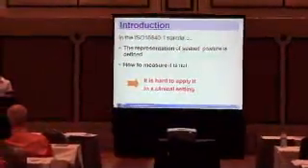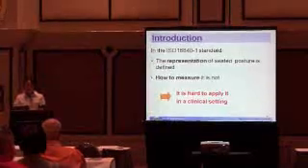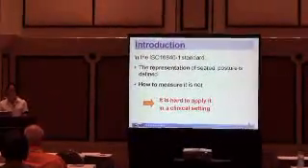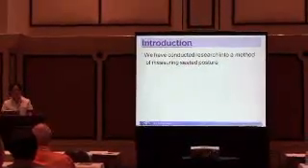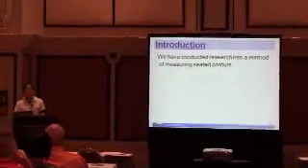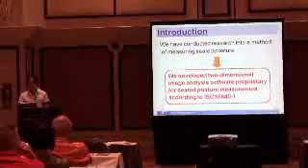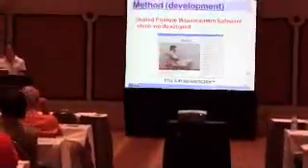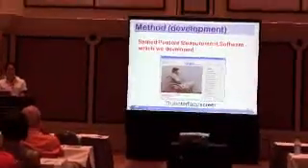In the ISO 16840-1 standard, the representation of seated posture is defined. The parameter is not clear, so it is hard to apply in a clinical setting. And we have conducted research into methods of measuring seated posture. And finally, we developed two-dimensional image analysis software proprietary for seated posture measurement according to ISO. And here is the interface screen of the software which we developed.